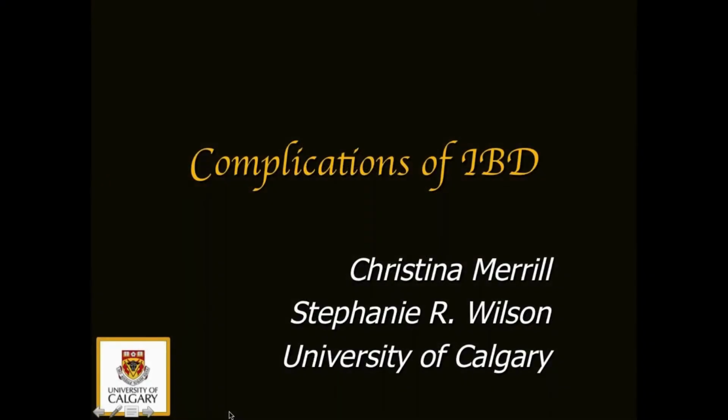So in this presentation, I will look at the complications of inflammatory bowel disease and our experience in looking at these with ultrasound. So I have worked in a large radiology facility for my entire career, and I've become intrigued with the role of ultrasound for this indication.